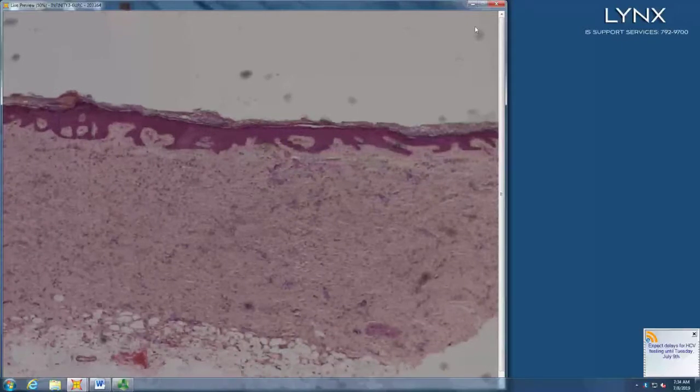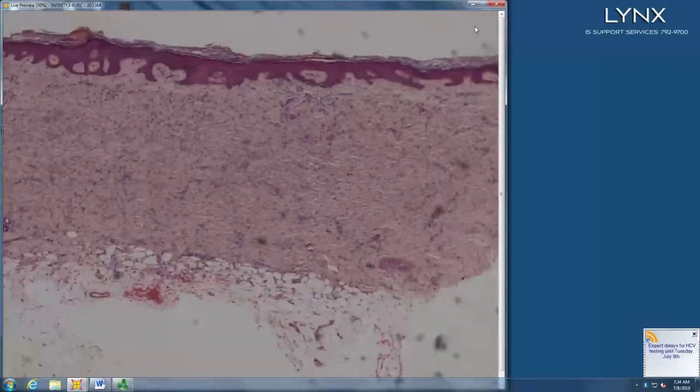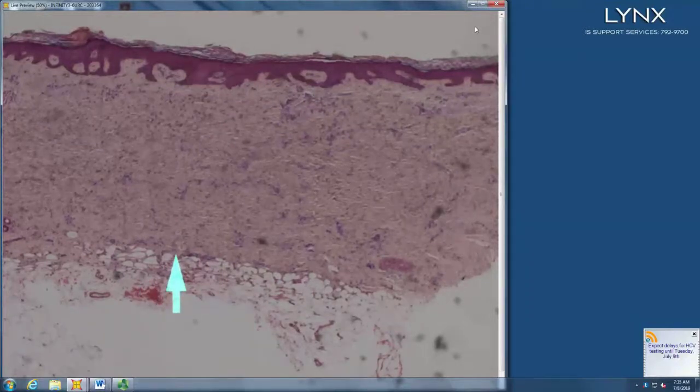Epidermis. So dermatofibroma, you have collagen trapping, epidermis, overlying acanthosis, lacy-like extension into the superficial fat. So name 3 proliferations that will have overlying acanthosis. DF, Spitz, and granular cell tumor.